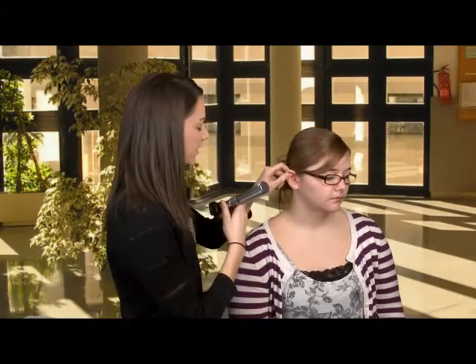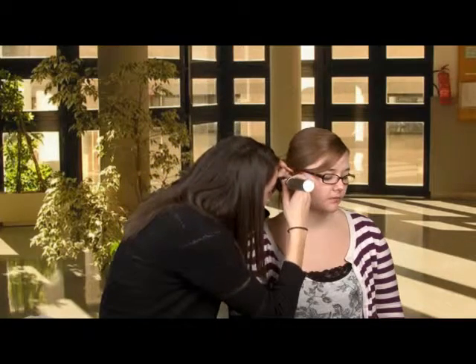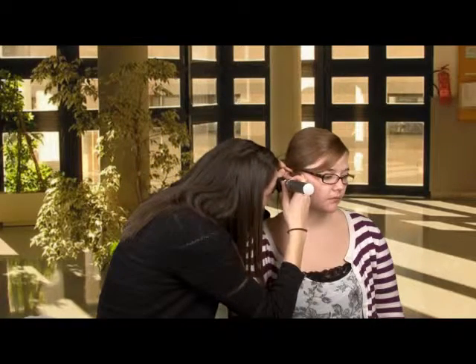This is the demonstration of the procedure of tympanometry. The first thing you're going to do is a physical examination of the external auditory canal and tympanic membrane. I'm going to look in your ears now. If at any point you feel uncomfortable, just let me know. I'm going to pull your ear up and back. Looks good.